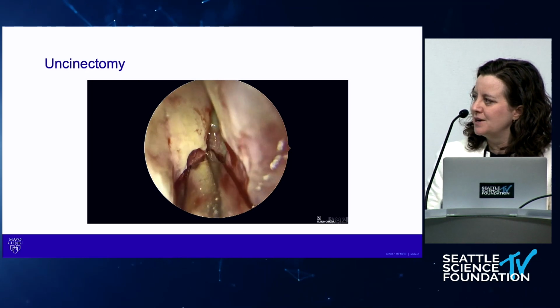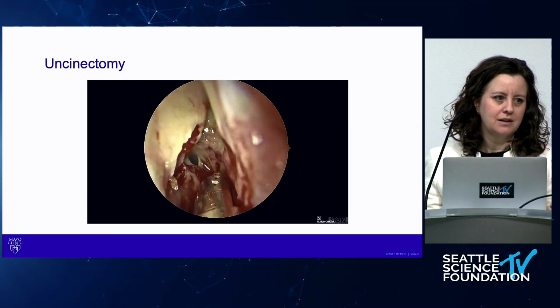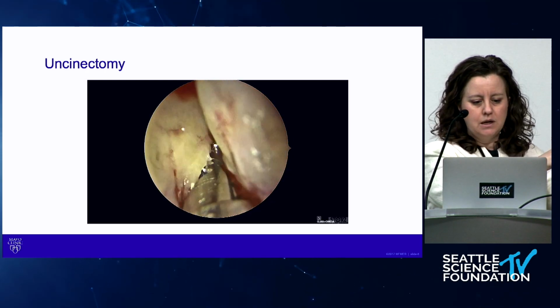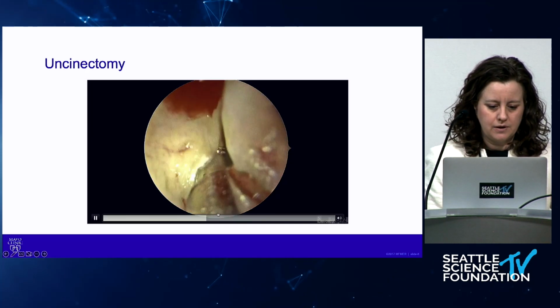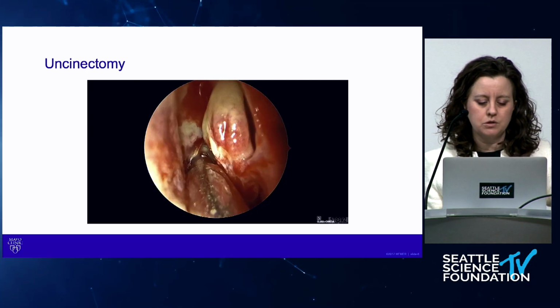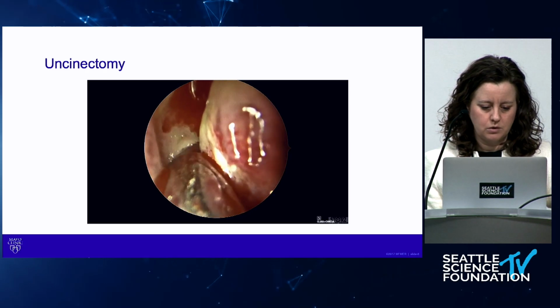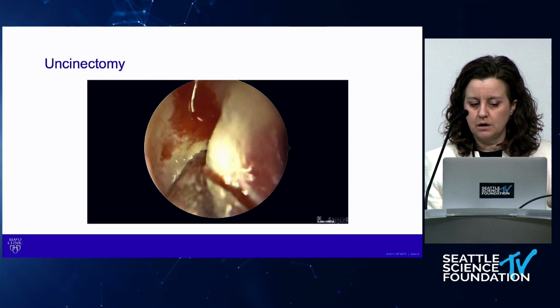The rules of microdebriding: you always see the opening. You never plunge it in where you can't see it. I'm taking off the vertical portion of the uncinate. I'm going to also take off the horizontal portion of the uncinate. And I'll fast forward just a little bit here. This person had a balloon procedure. We could see that that balloon didn't go where it was supposed to. This is why he's having revision surgery, because he still has disease. So taking more uncinate off, you can start to take it up towards the agger.